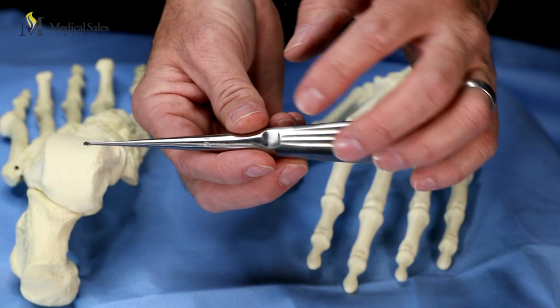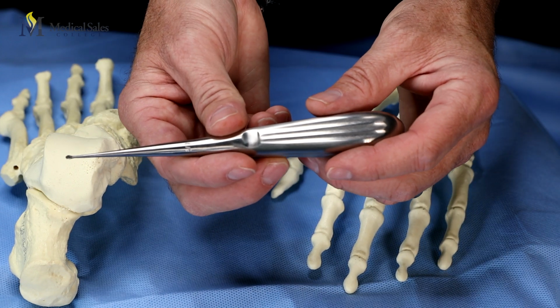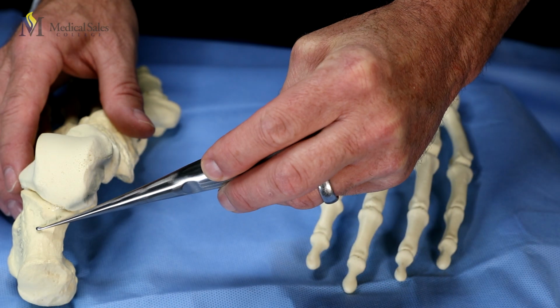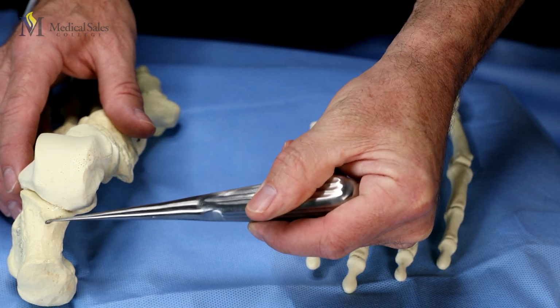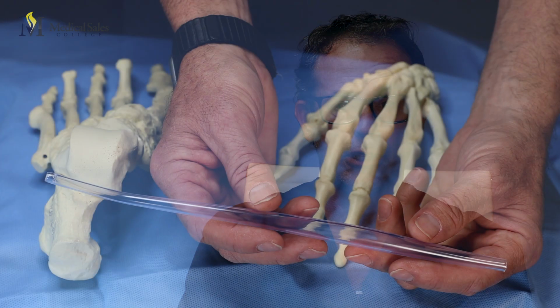Curettes is another name for a spoon-like instrument that helps remove soft tissue and bone. There are solid curettes that act like a melon baller, that have a very sharp rim to peel away soft tissue and bone. And there's also ringed curettes that look like a ring where there is a hollow center.